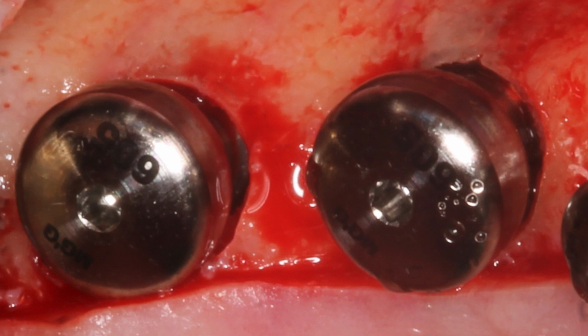But more so than that, from a biological point of view, if you assume that bone was in direct contact with the healing abutment, of course, the healing abutment is not going to be part of the osseointegrated implant system. It's only going to stay there for a short while, and then soft tissue has to form its biological complex. Soft tissue cannot form directly in between the bone and the healing abutment, so therefore the body will provoke a low-grade inflammation.